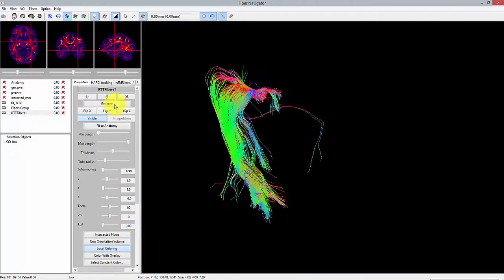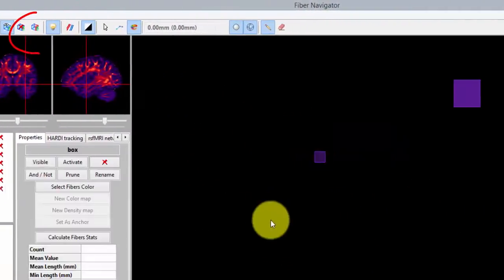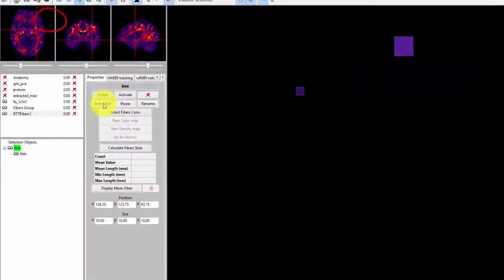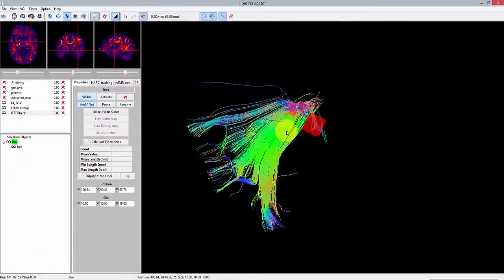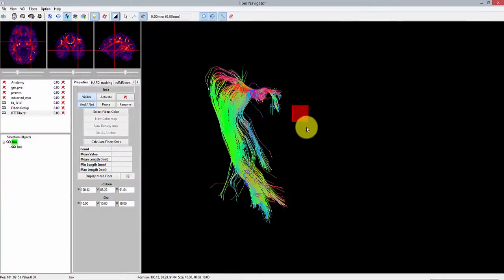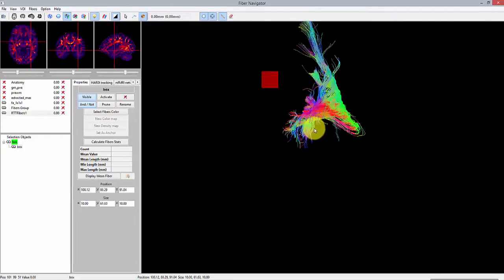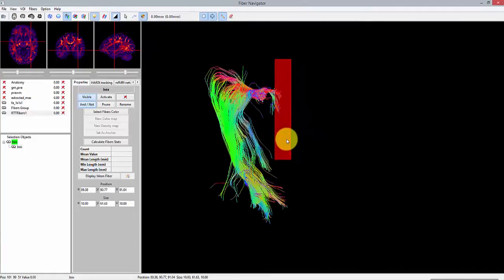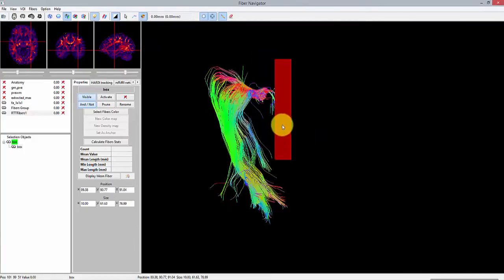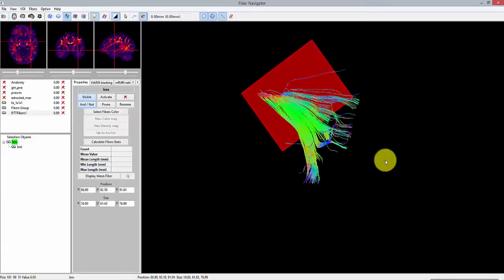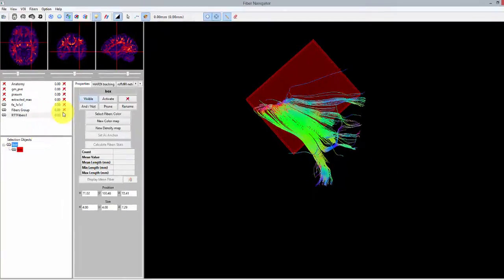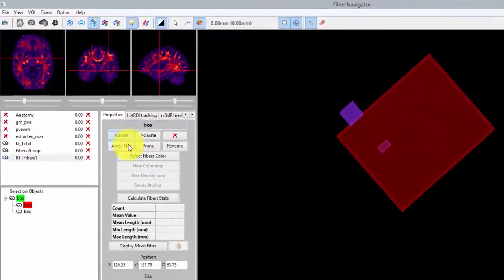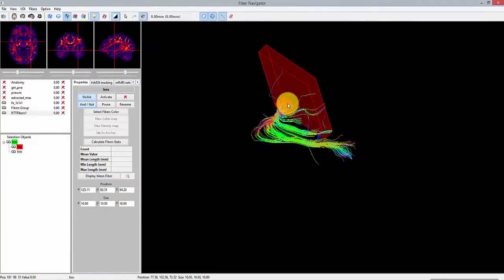So we are going to add a new region of interest, which will be an exclusion region. Remember you might want to remove some of the fanning depending on your analysis. This can be done by adding another exclusion region at the same level as the previous one.